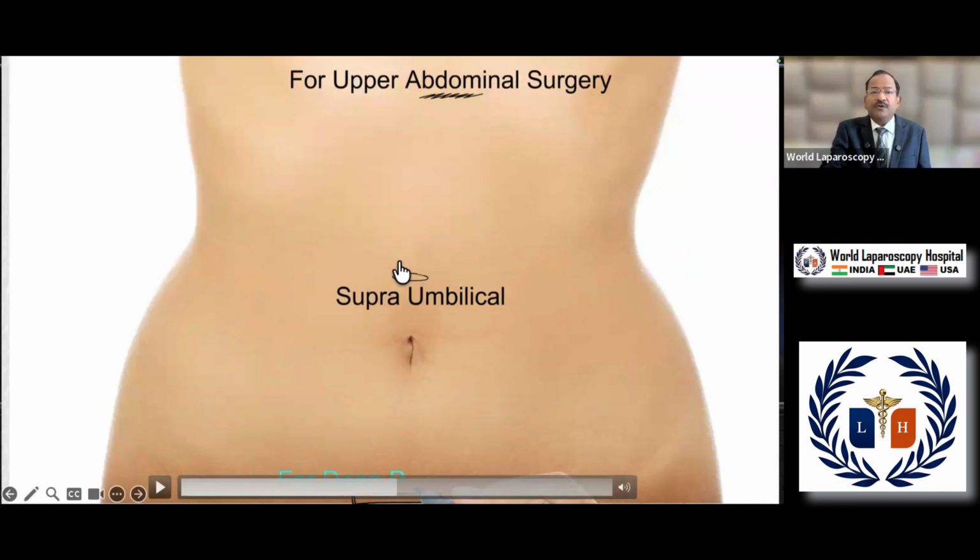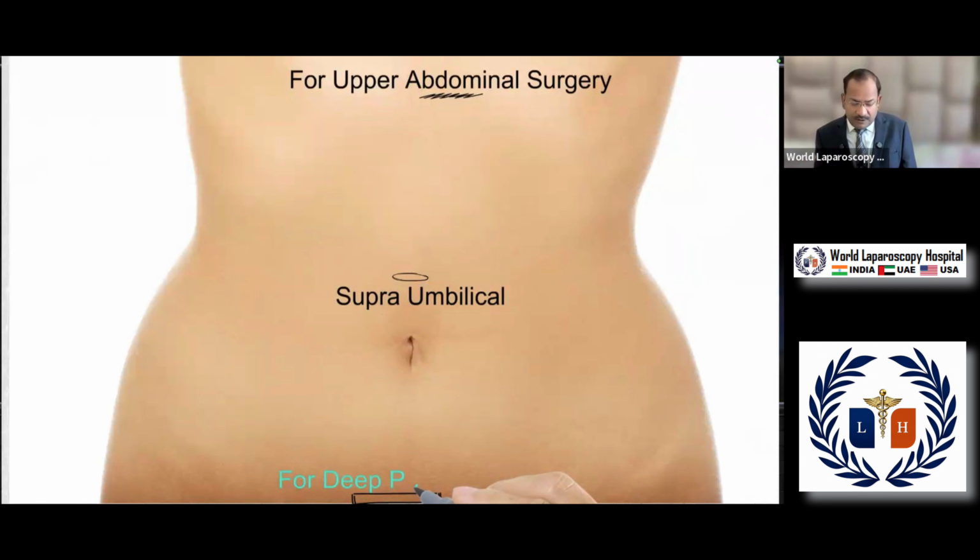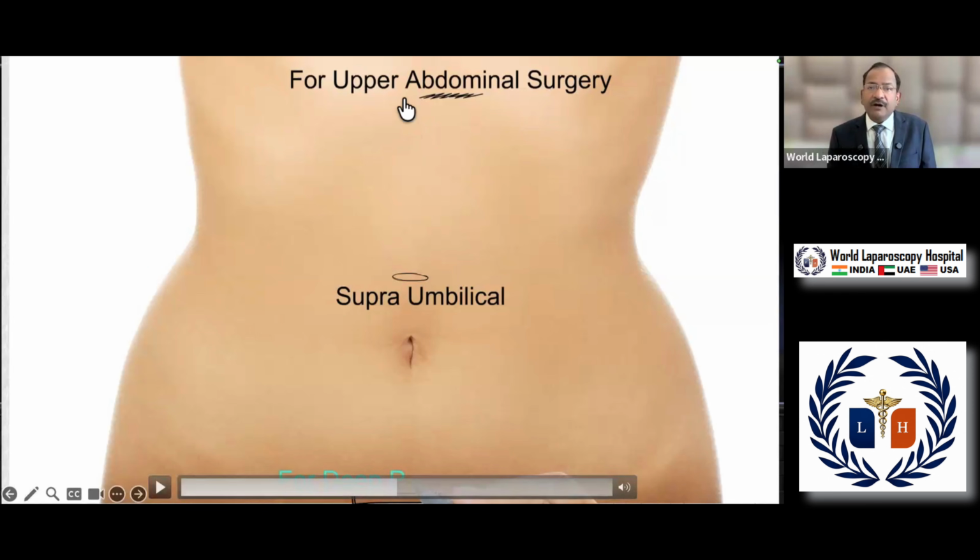Our reference point should be the xiphisternum, and you should remain 18 centimeter below the xiphisternum in a normal patient and 22.5 centimeter below the xiphisternum in the obese patient.